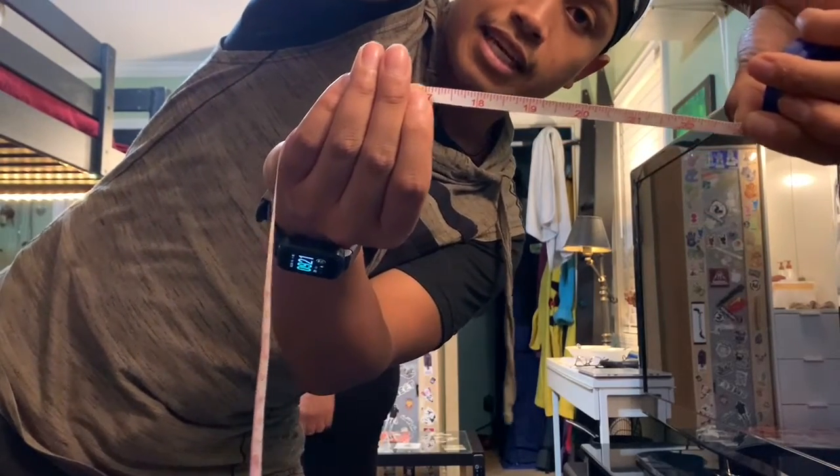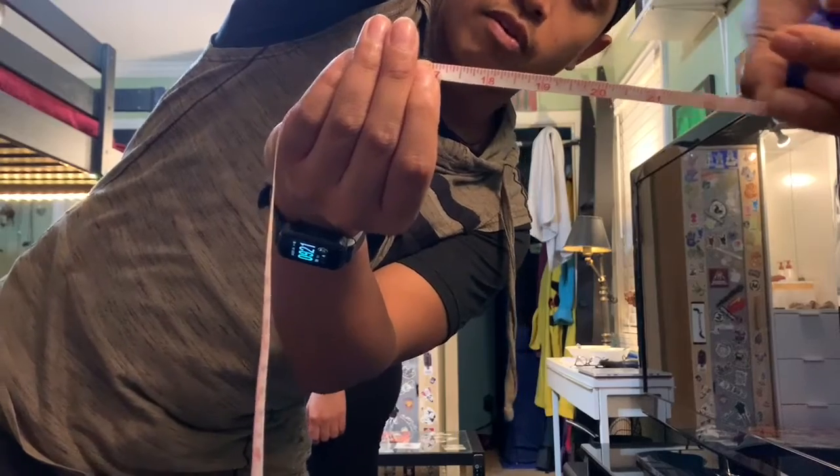That is an extra six inches for trunk flexion. And that concludes the measurements for knee flexion, cervical lateral flexion, trunk flexion, and elbow flexion. Thank you and have a nice day.